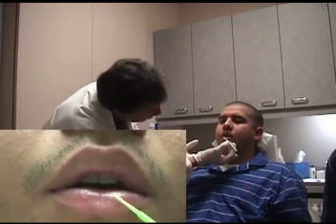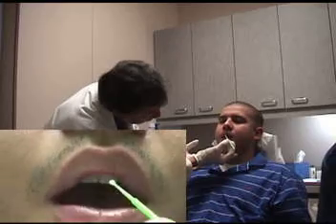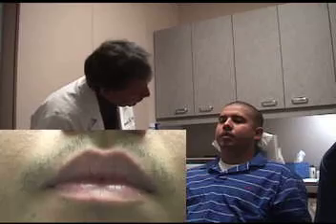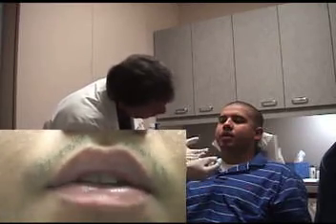That's great. Let's start over. 66, 67, 68, 69. Stop. Okay. We'll try it one more time. We'll just do it. Just relax. There you go. And go ahead. 66, 67, 68, 69. Stop.